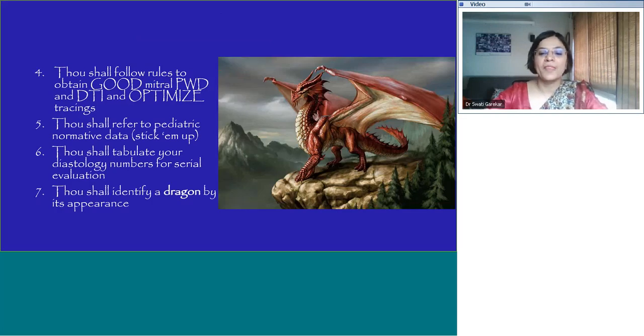Most importantly, if you see a dragon, know that it is a dragon. Don't go about pulling out your smartphones and opening up Wikipedia to find out what a dragon looks like, how many claws it's supposed to have. What I mean is, when you have severe systolic dysfunction, for example, you're going to have diastolic dysfunction. If your indices aren't adding up and giving you a clear picture, there's a problem with your data, or there are things impacting how you're studying your diastolic dysfunction.